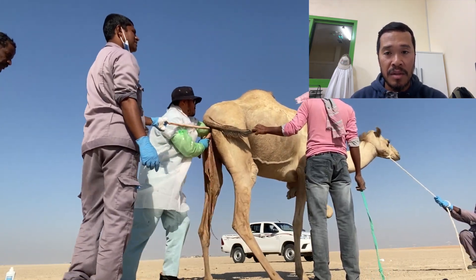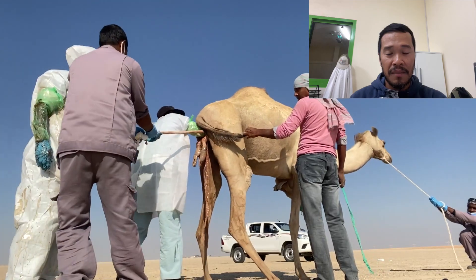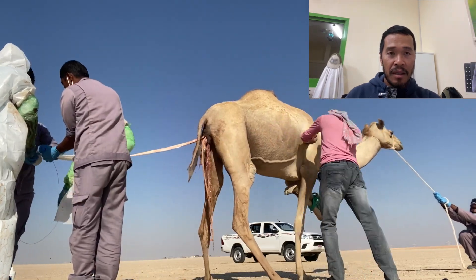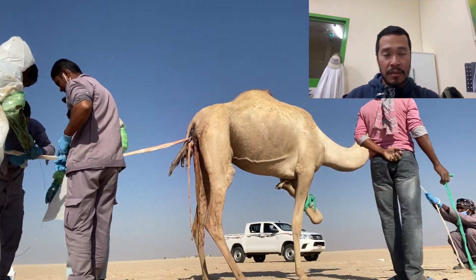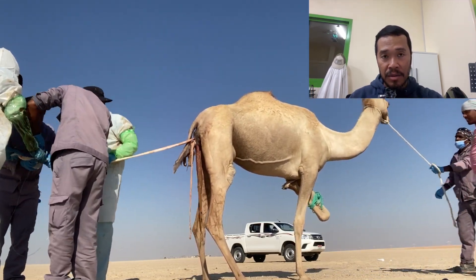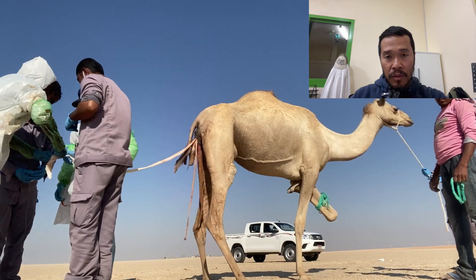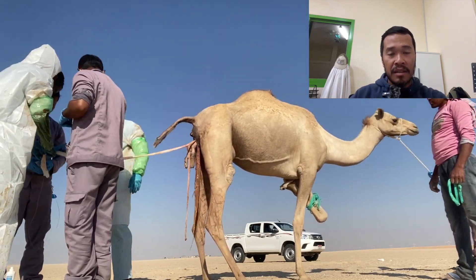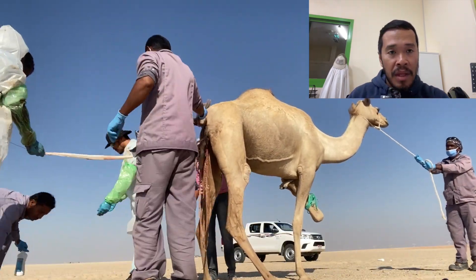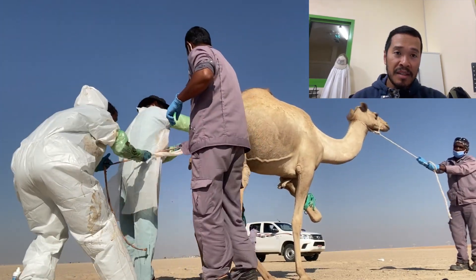The fetus's position made it very difficult to deliver because the limbs were presented first — the feet — but the limbs were over the head and neck of the fetus. The fetal head was down and basically blocking the exit.